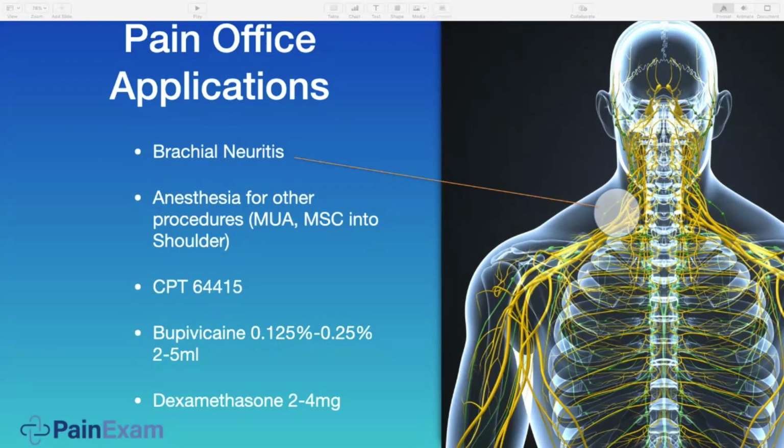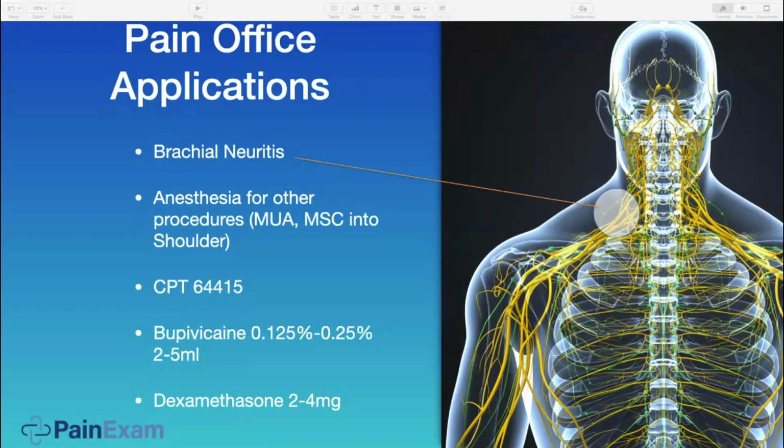And you ask, why are you doing an interscalene nerve block in the office? You can get phrenic nerve paralysis. Well, I'm using very low volume and, as I mentioned, low concentration. Sometimes I'm diluting with saline, and I'm observing them afterwards. None of them have hemidiaphragmatic paralysis beforehand. If they have COPD, I'm usually not doing it, or I'm doing something different. So I'm being careful. I'm screening my patients. I'm not just blindly doing this, expecting everything to be okay. I do have resuscitation equipment and monitors in my office. However, I've never needed to use them after this procedure.